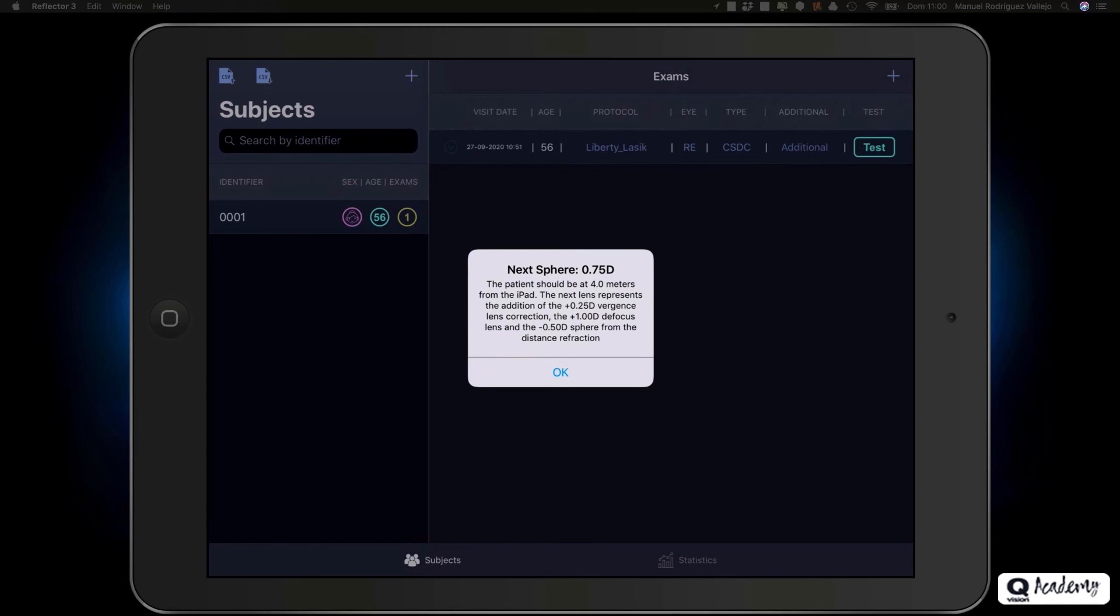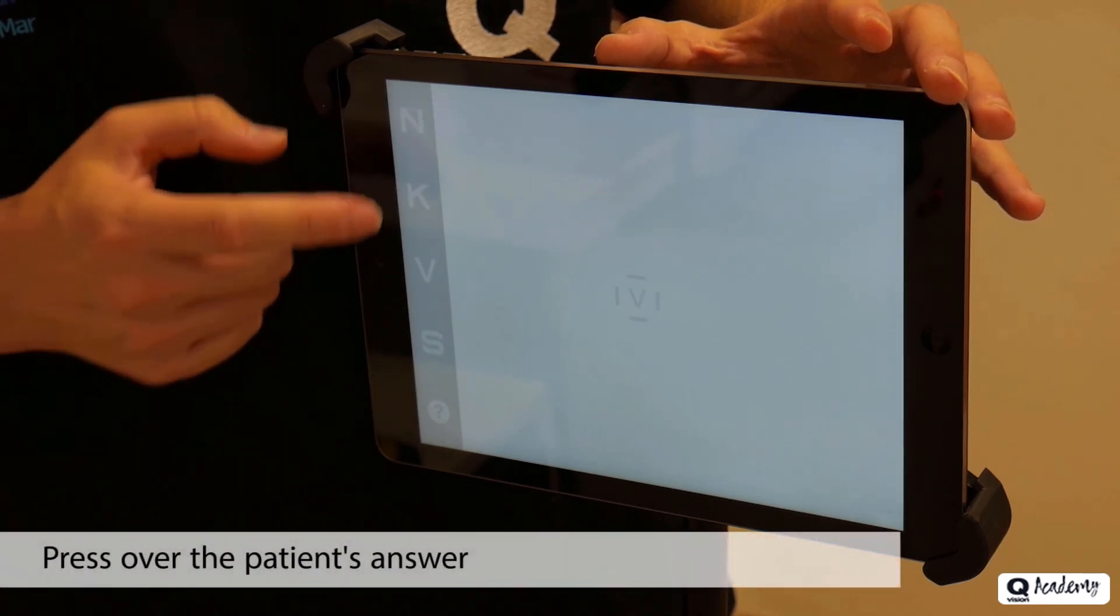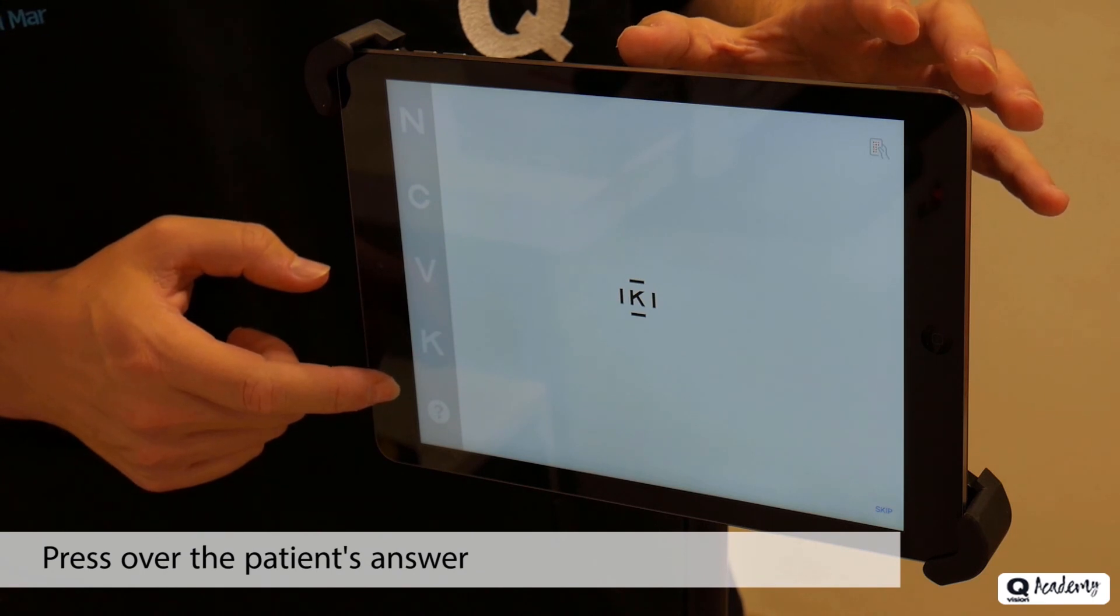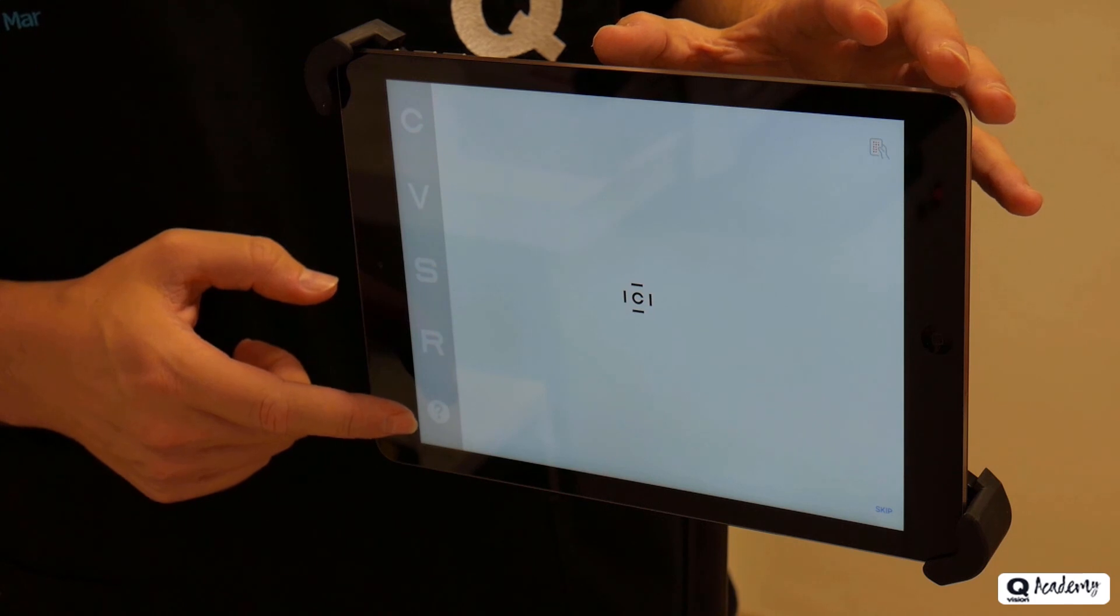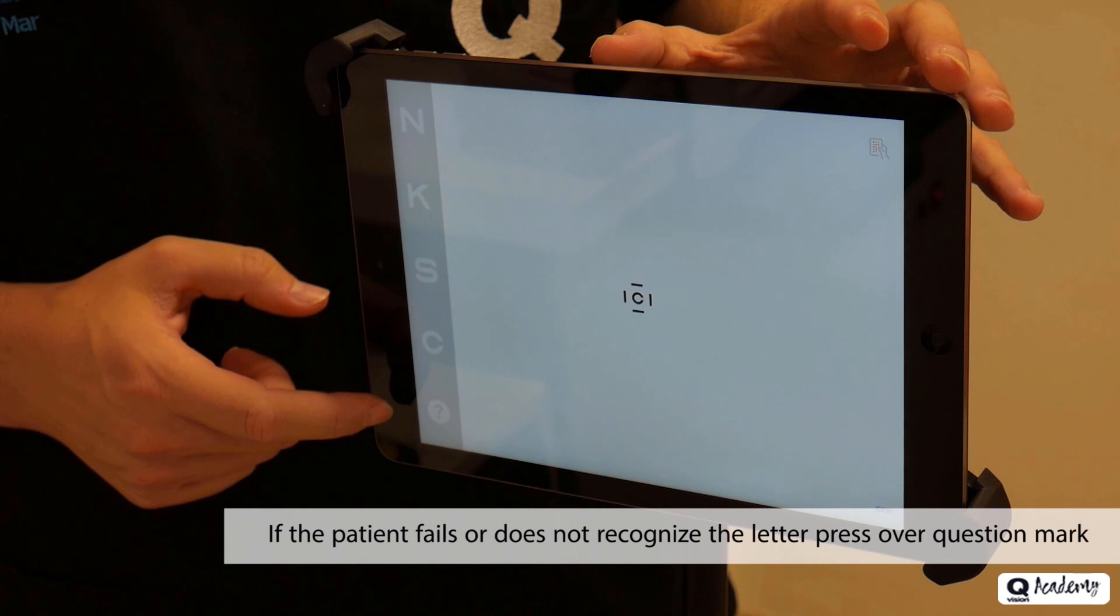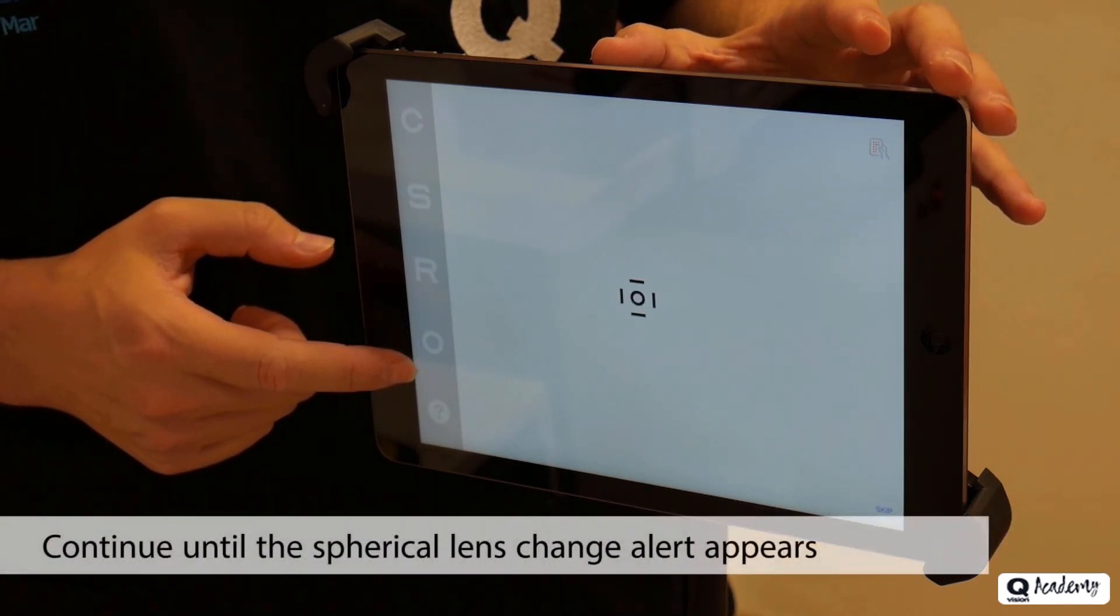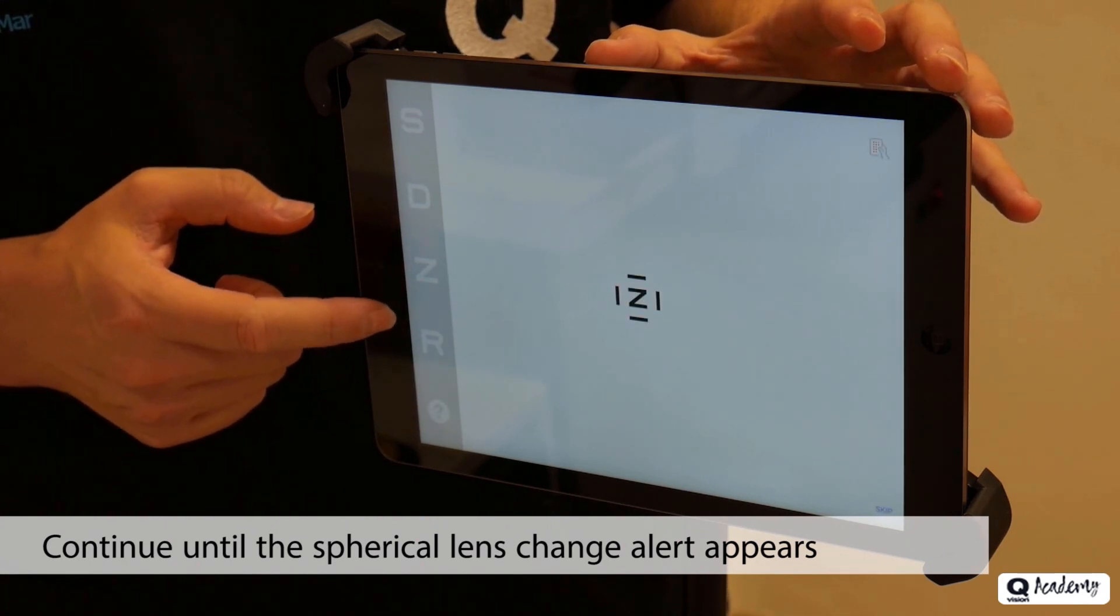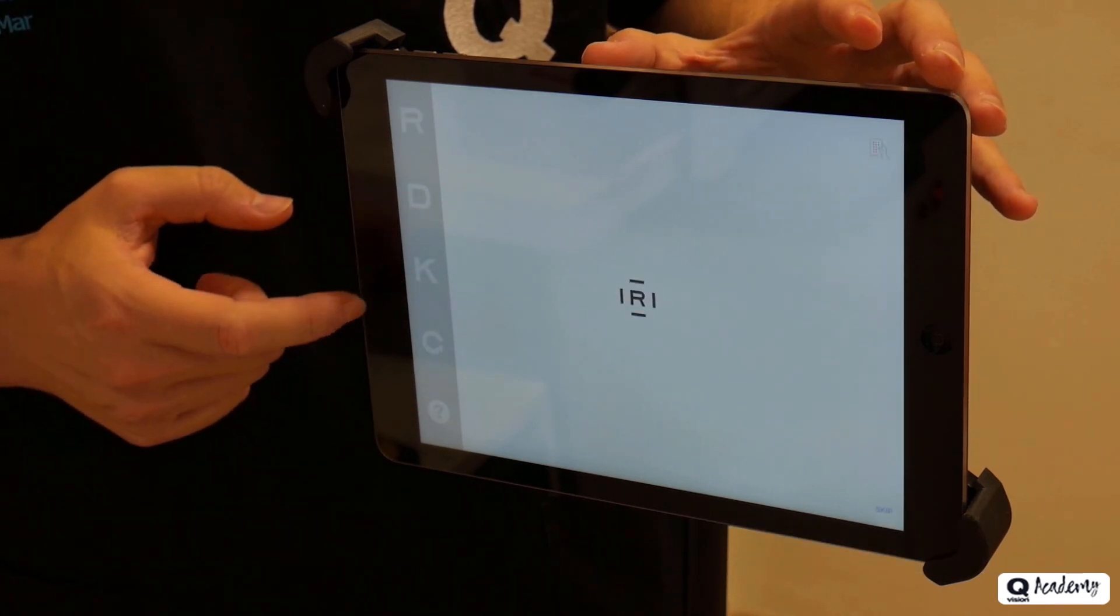Click OK to start the test. During the test, you will only have to click on the letters that the patient responds to. The application will automatically adjust the size of the optotype or its contrast, depending on whether we measure the visual acuity defocus curve or the contrast sensitivity curve. If the patient cannot recognize the letter, or the answer does not match any of the options to be clicked, click on the question mark button corresponding to an unrecognized or erroneous letter. We must continue this process until the alert appears with the next spherical lens to be entered.